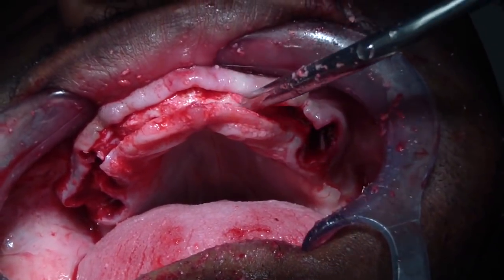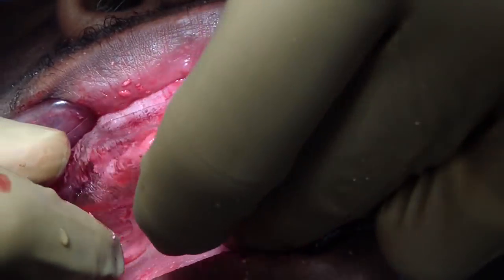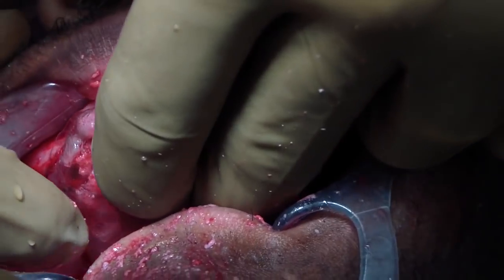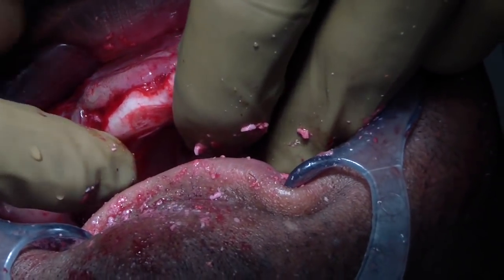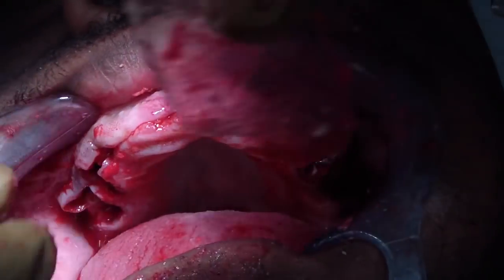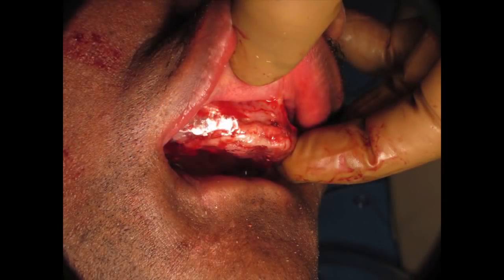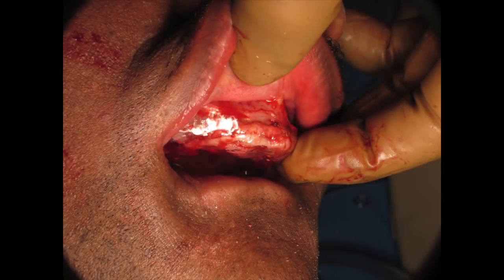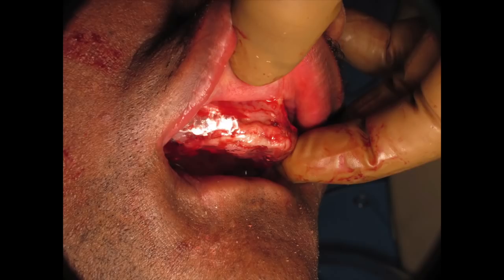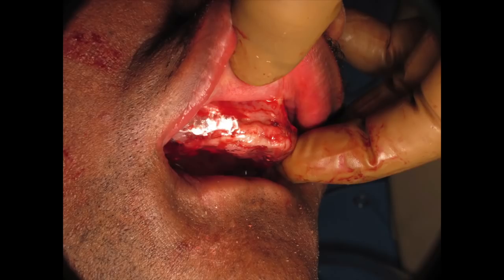We are going to continue on with part two of the video. We have completed the alveoplasty procedure and are just going to try in the surgical stent after removing some of the osseous tissue, to see if there is anywhere that is binding. This is a fairly rough guide, but it enables us to get a view of whether we need to make any contour changes. It looks about right — we have generalized blanching of the tissue all over instead of just one or two spots.